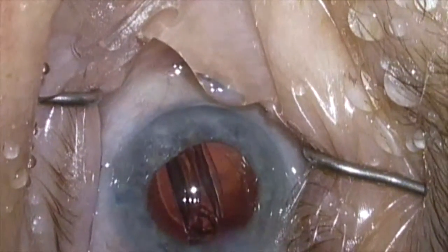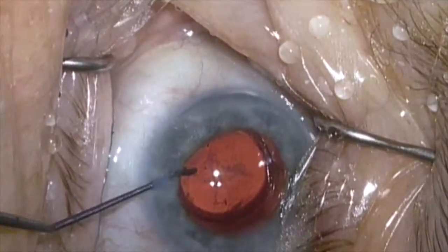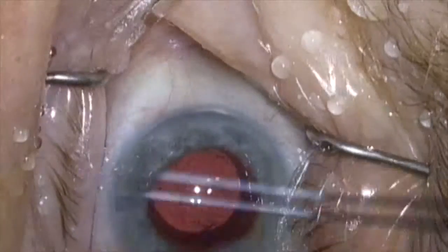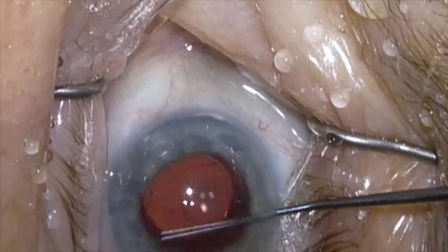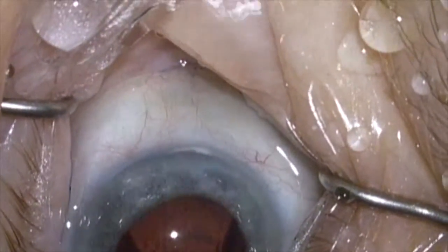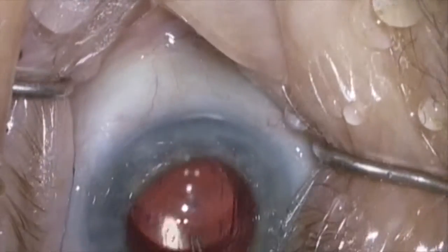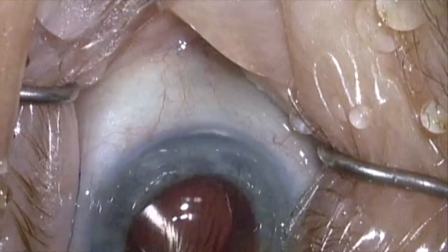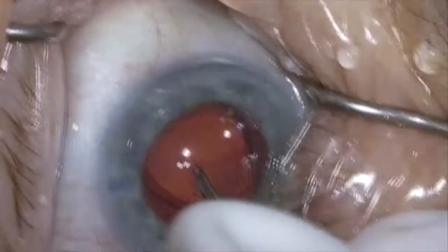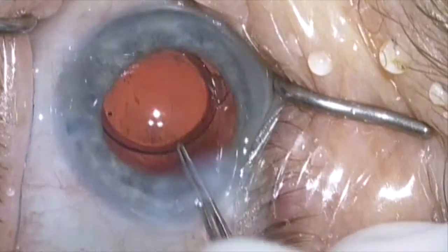The lens is placed in the capsular bag and rotated into position. With the lens in the capsular bag, I'm going to use the anterior capsule sweep to clean some lens epithelial cells on each side, then inject viscoelastic under the lens to lift it away from the posterior capsule. Now I can peel this plaque off the posterior capsule using Utrata forceps, with the confidence that the lens is already in the eye — and if I inadvertently tear the posterior capsule, it's not the end of the world. This is successfully completed without tearing the capsule.